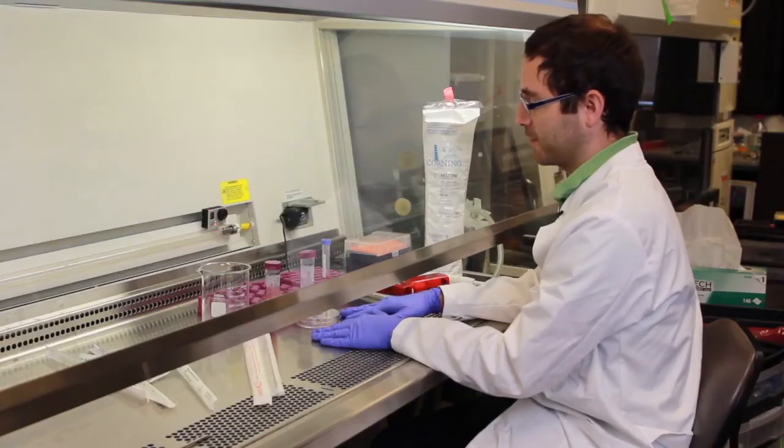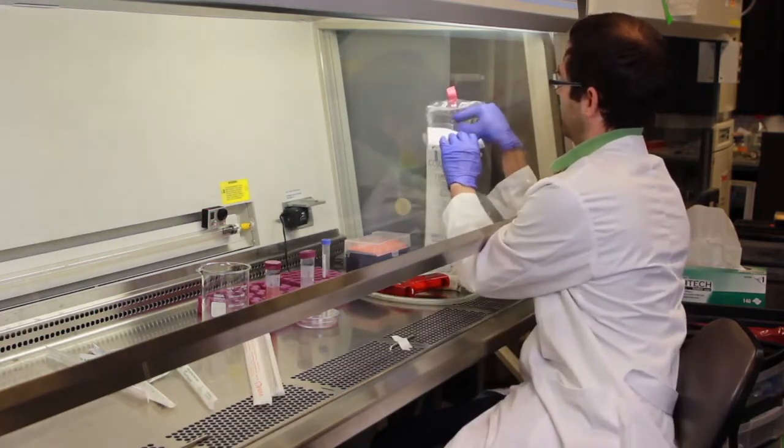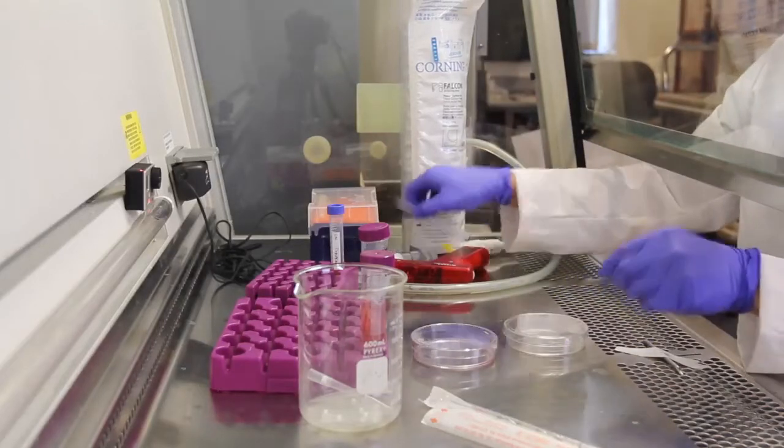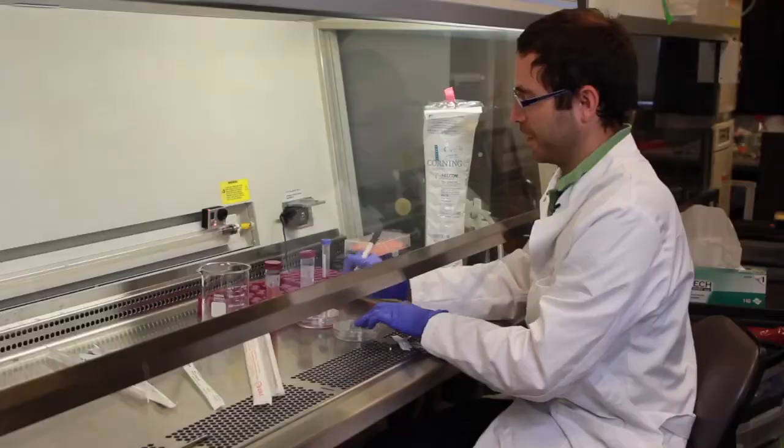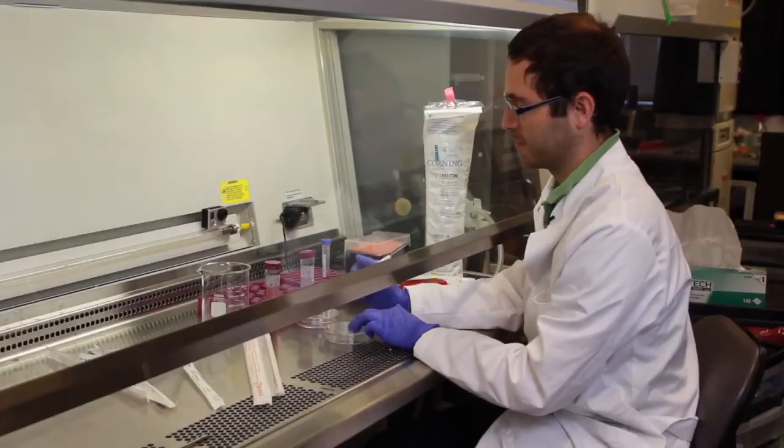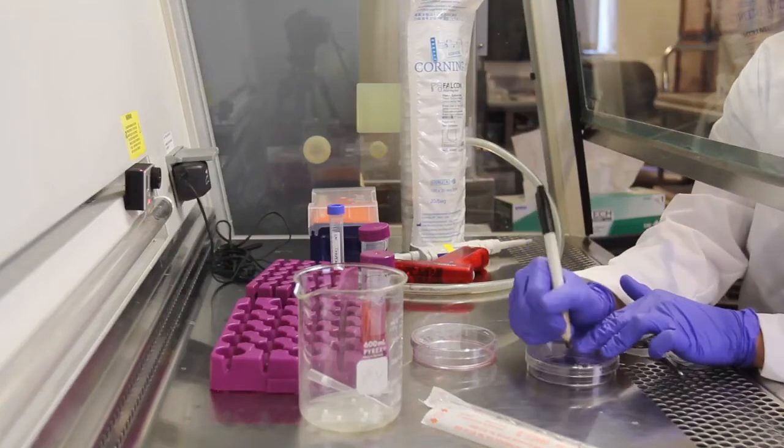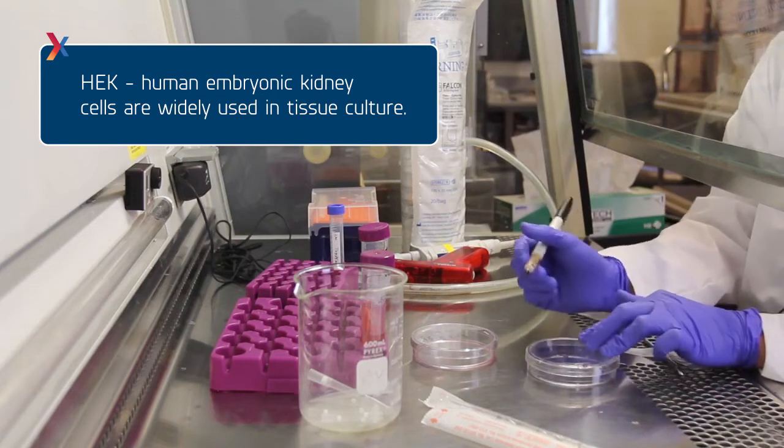After about a minute I like to prep the next plate that the cells will be split onto. So take a clean plate from this stash and each plate should be labeled with a few different things. For one there should be either your initials on it or some sort of identifier of who they belong to. You want to indicate what type of cells there are. In this case it's human embryonic kidney cells, abbreviated HEK.